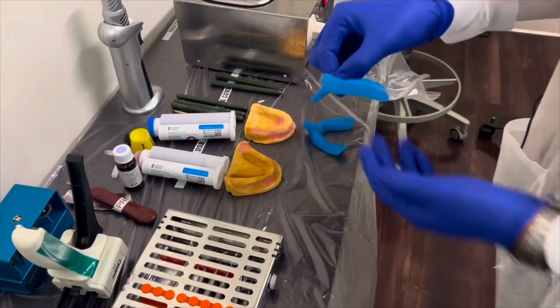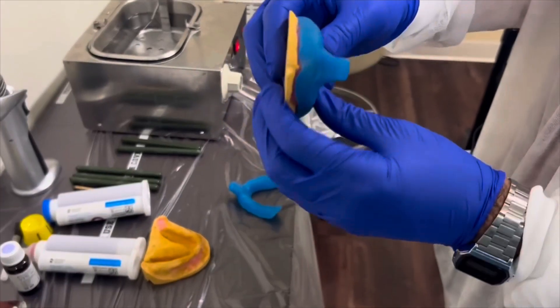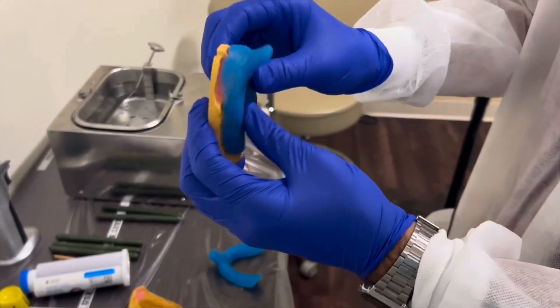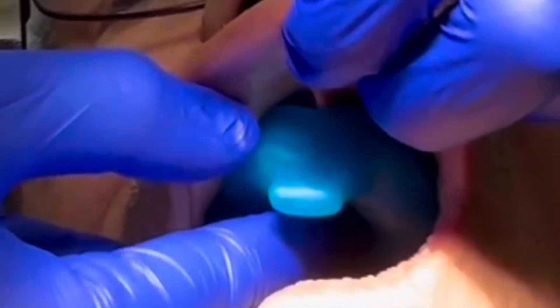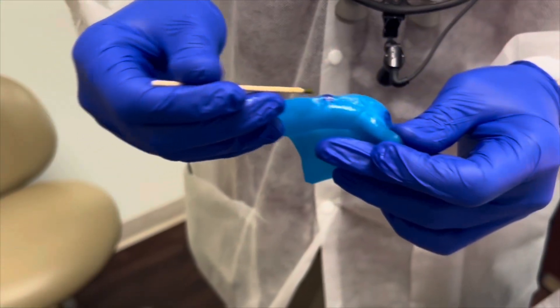First, we'll check the custom tray against the diagnostic cast. The custom tray was made to be two millimeters short of the depth of the vestibule on the cast. However, upon clinical inspection, we noticed that the tray is right up against the border tissues, especially in the frenum areas. These are areas to be marked with a Thompson stick marker and adjusted using our straight hand piece.